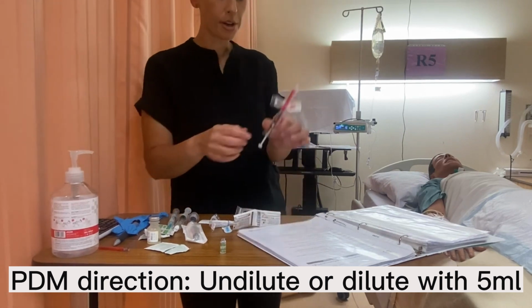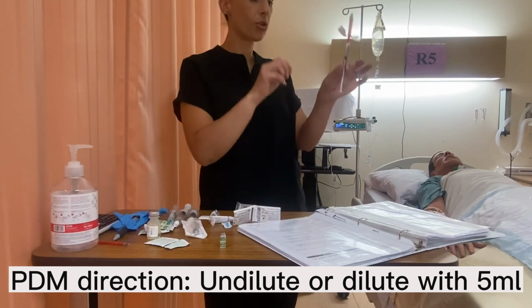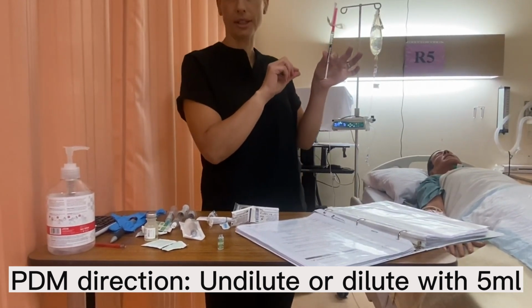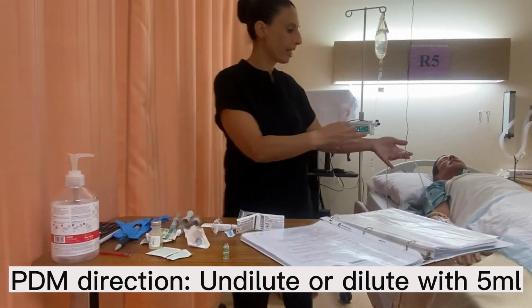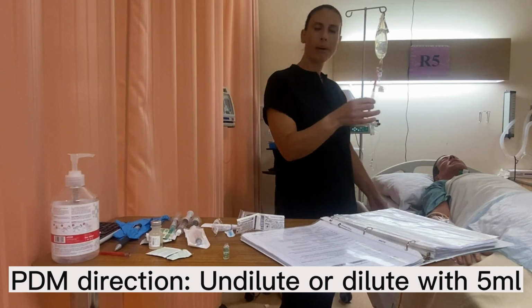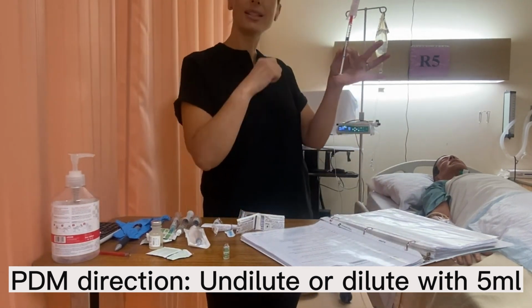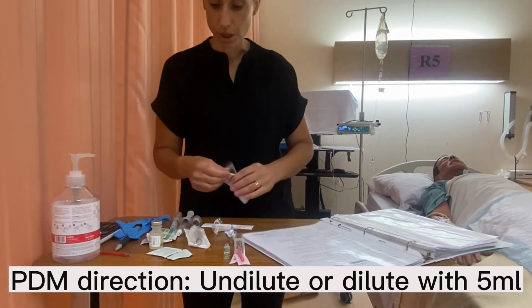So it's really hard to give 0.5 mLs over 4 to 5 minutes. So we'd be pushing very small increments, like 0.1 increments. It can be done, but sometimes the ports will hide medication and it'll get stuck in there. So it might be better if we dilute this so we have a bit more volume and it's easier for us to push. But it is completely up to you, your discretion.